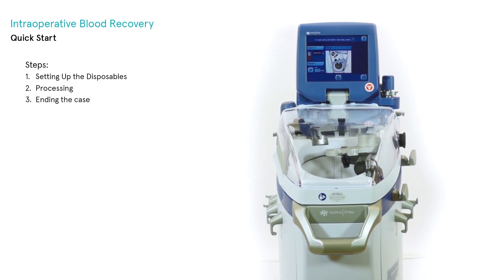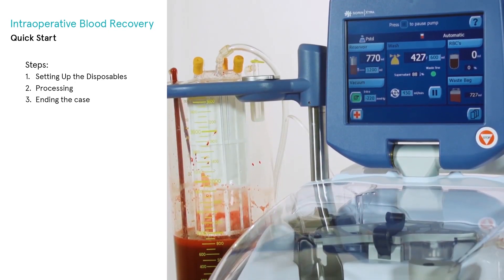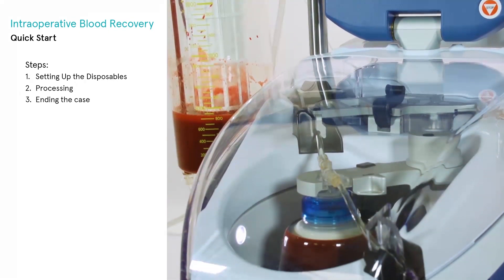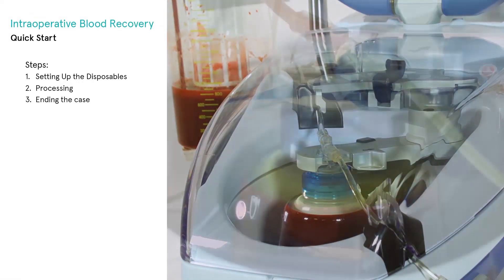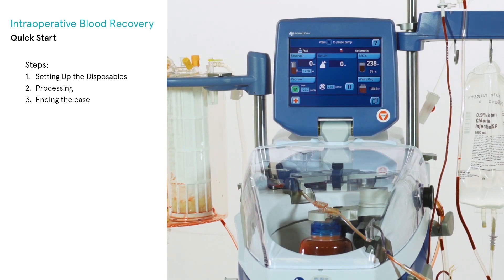Introduction to setting up the Extra ATS for collection and processing. Intraoperative blood recovery is generally indicated in all major surgeries with an anticipated blood loss of greater than two units. This is the level at which autotransfusion becomes a cost-effective and viable option to return the patient's own red blood cells to assist in avoidance of red blood cell transfusion.